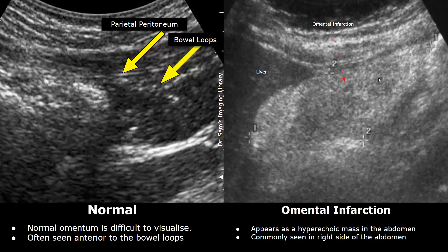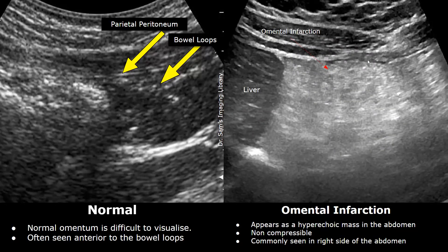Infarction most commonly occurs in the right side of the abdomen. In this image, we see a hyperechoic mass inferior to the liver. After further investigation with CT, it was found to be an omental infarction. Here is another image showing an omental infarction, also on the right side. A hyperechoic mass is seen inferior to the liver. It will be a non-compressible hyperechoic mass.